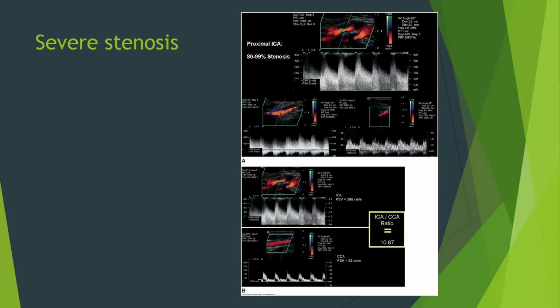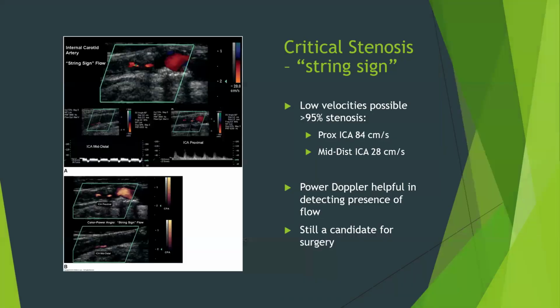So whenever we get a stenosis, it's important not only to find that elevated velocity, but then especially, in this picture here, showing our post-stenotic turbulence within the waveform itself, okay? So important to get the stenosis, get the post-stenotic turbulence as well.